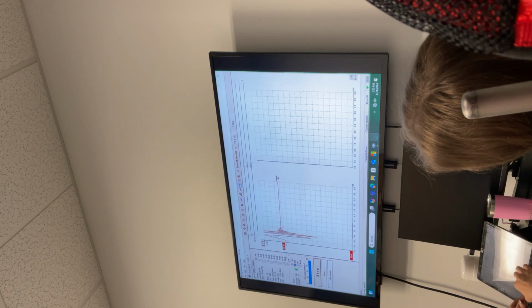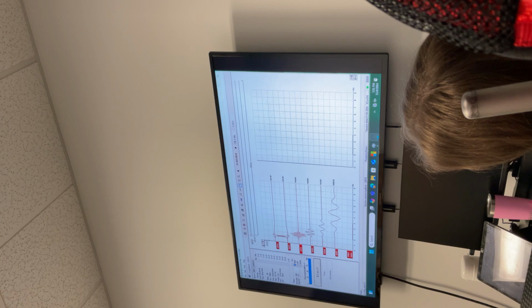So this is the broadband chirp. Earlier I made a statement that 0, or in this case minus 0.9, is the onset of the sound. When you look at the clicks or the tone burst, I can go here. See here?